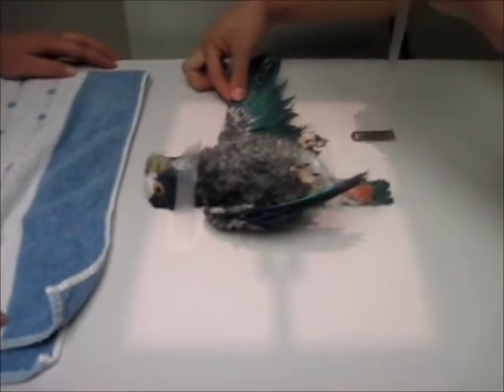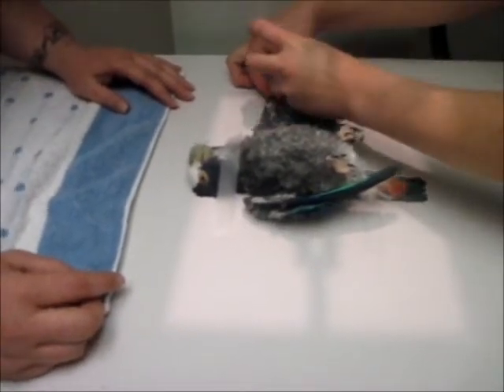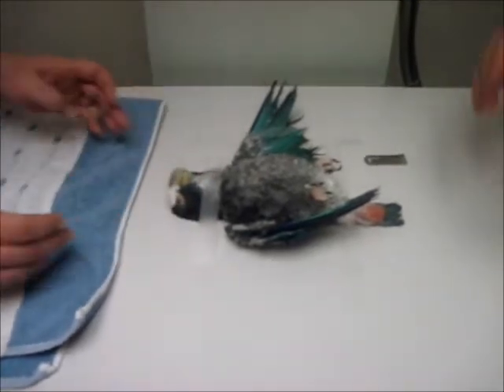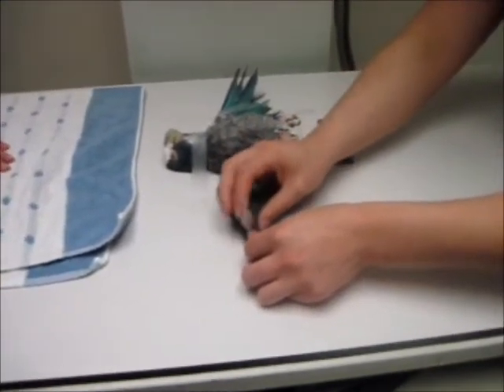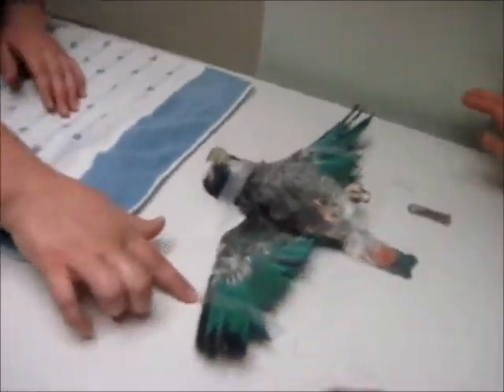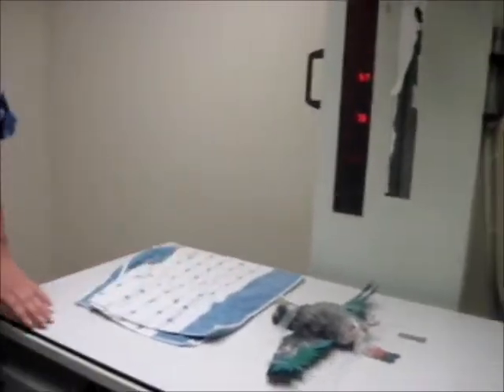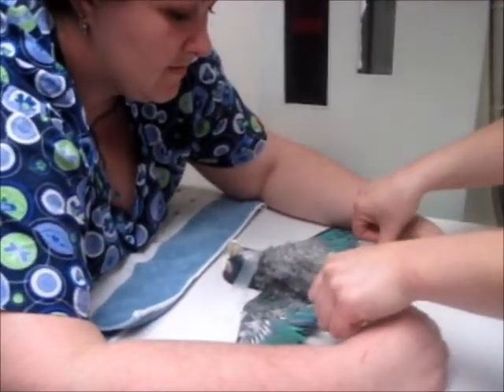Then you want to expand each wing and tape them down one at a time. Last, you are going to tape down the feet — this will make sure that they are extended and not in the view of the x-ray. Then you want to make sure the center of the beam is directly over the sternum, and then you can take your x-ray.